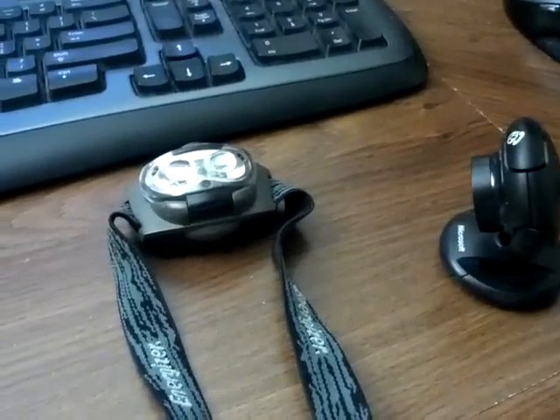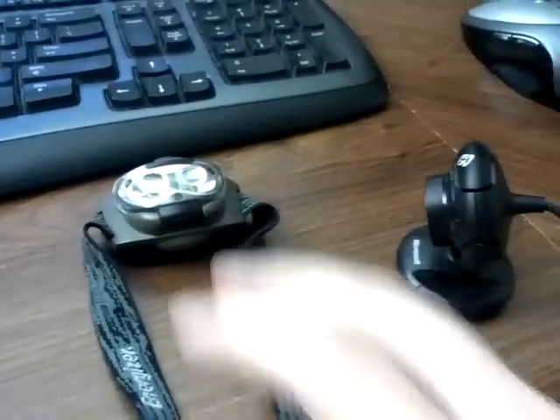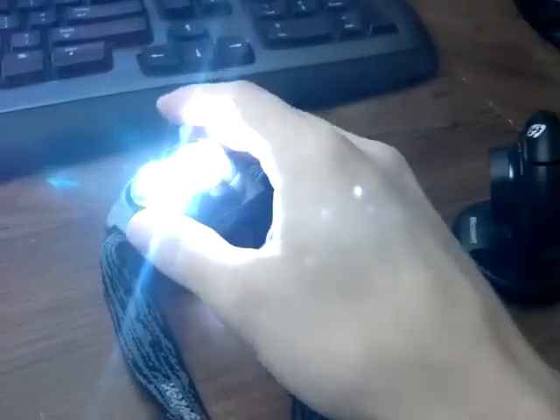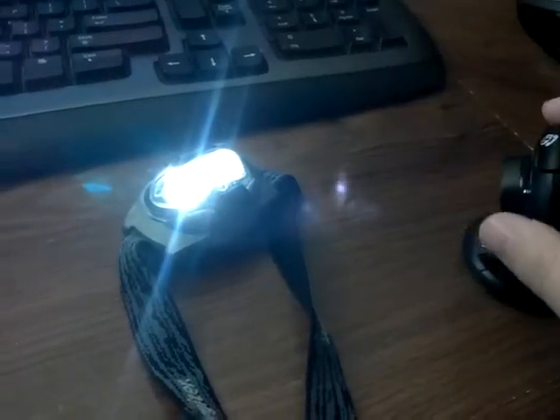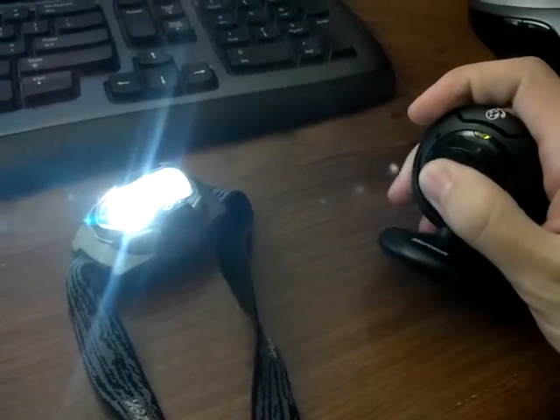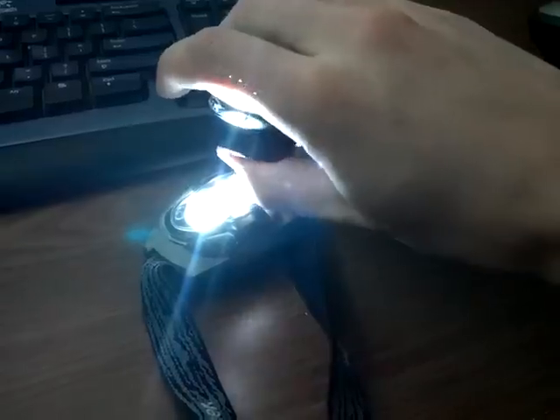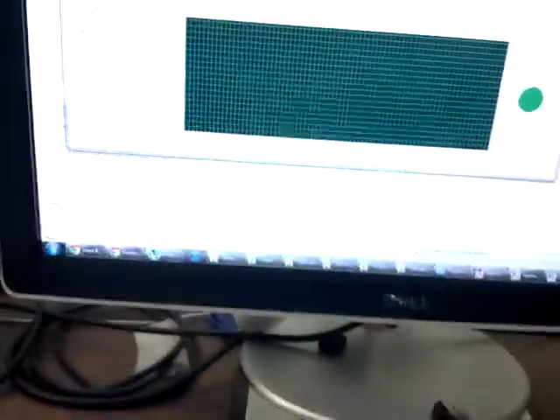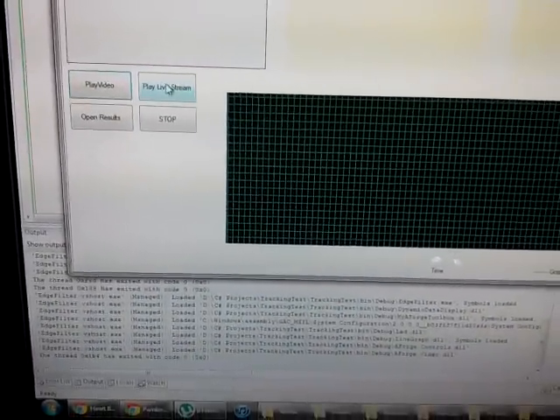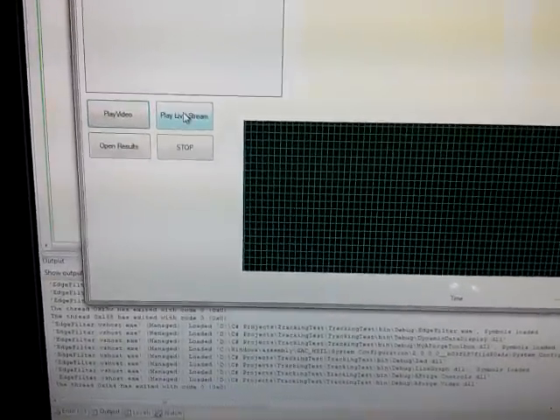Alright, so I got my webcam and my flashlight. Go ahead and turn the light on. What you do is you just cover your finger, stick it over the light, then we go over here and click play live.